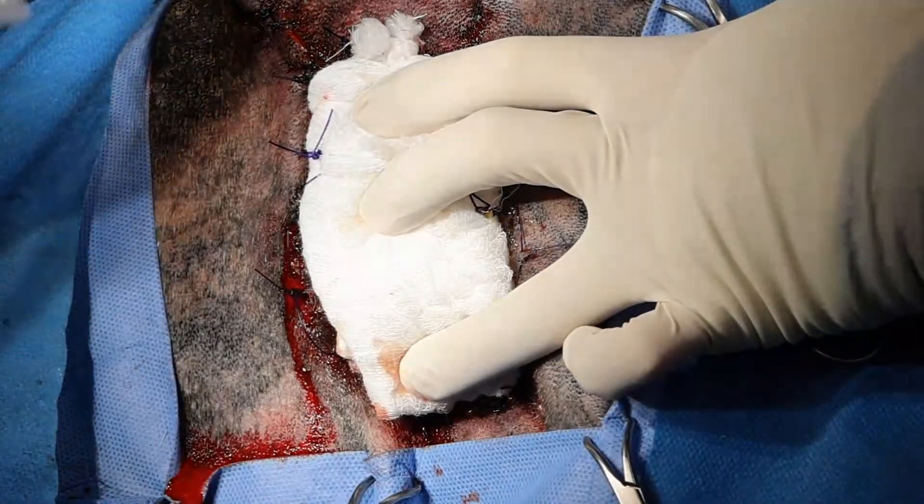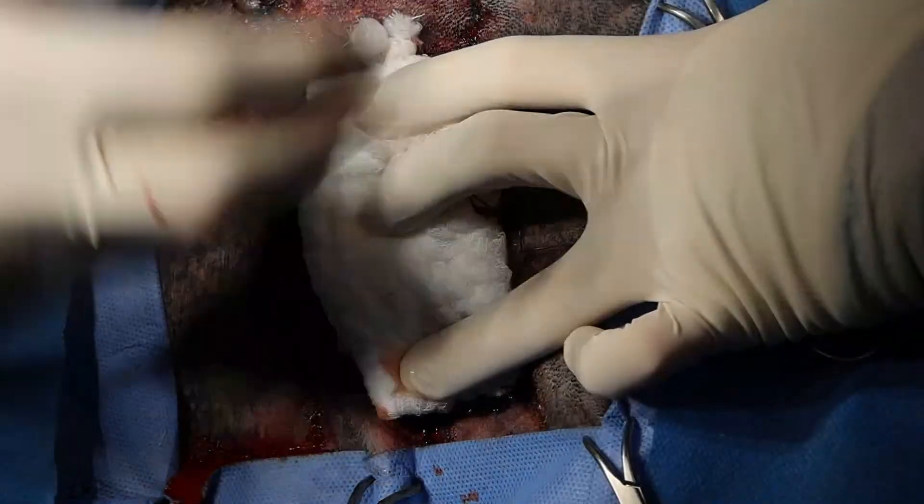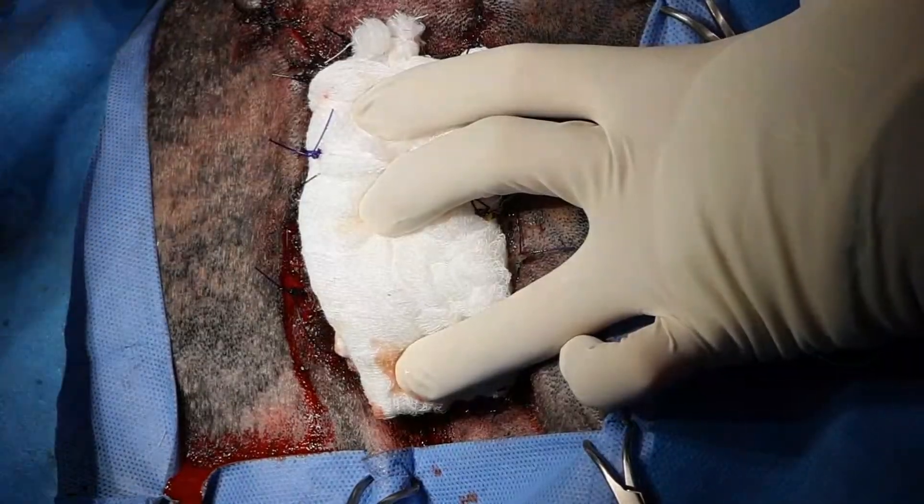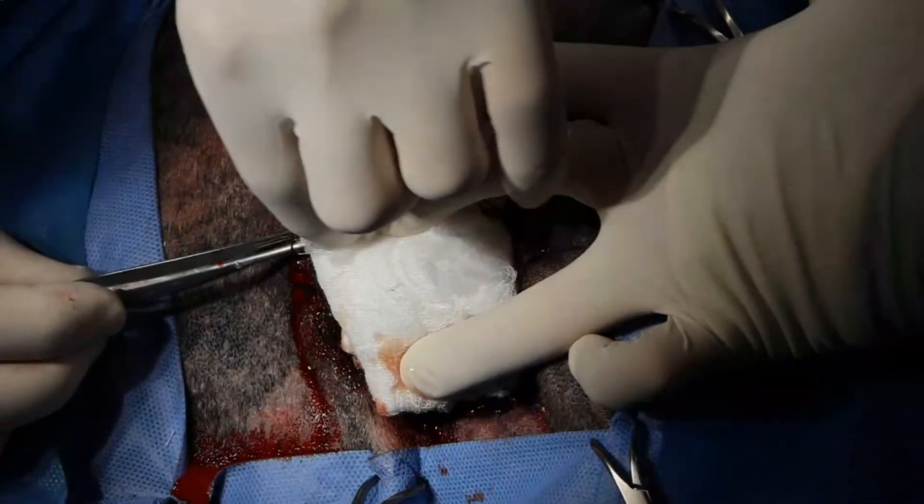When doing an enucleation, I usually don't remove the fat from the eye socket if it's connected. If you have loose fat in there, obviously that's something you'd want to take out because that will necrose.